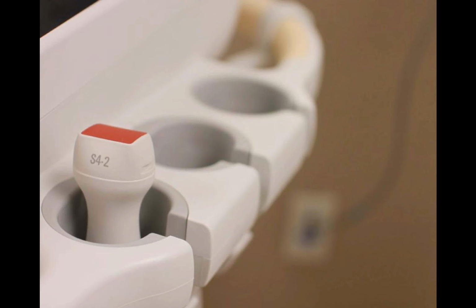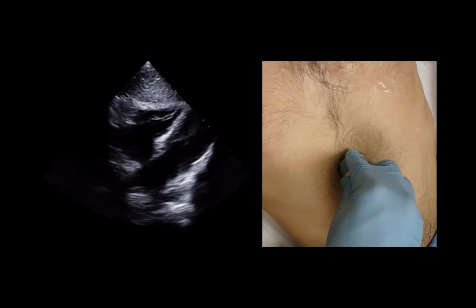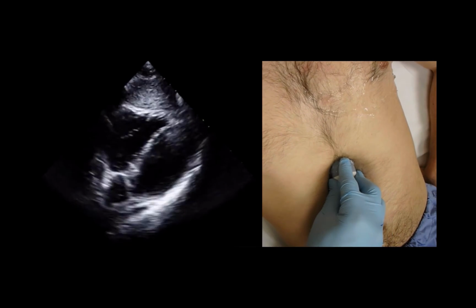Now, as far as where to put the probe on the patient, you can put it in any of the four basic cardiac views, but the subxiphoid is going to be your best view. What you're going to do is grab the probe with an overhand grip, put it in the subxiphoid area and just look around, angle until you see that subxiphoid view.